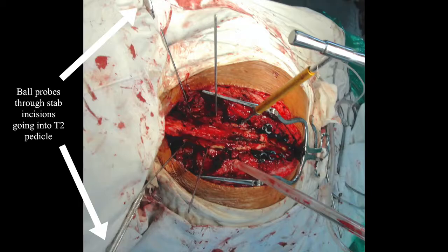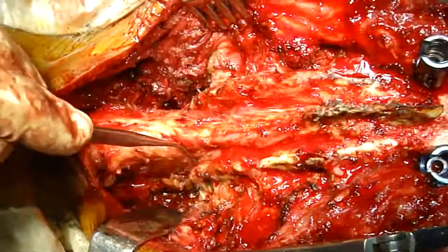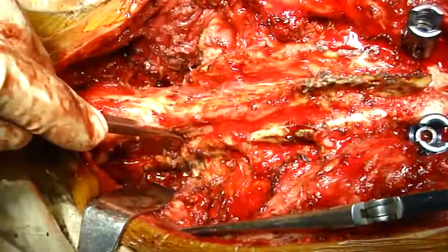The upper thoracic spine was not visible clearly on lateral fluoroscopy. Hence, taking advantage of the midline defect, the pedicle walls were palpated using a probe to ensure correct placement of screws.